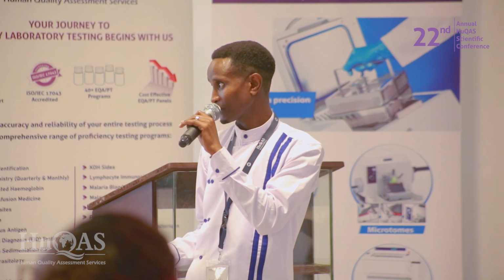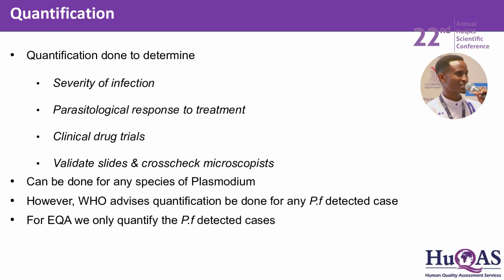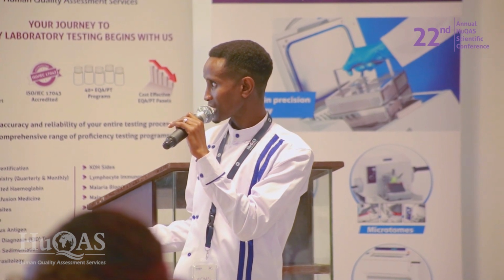But there's an aspect we will also discuss here about EQA, which is advised at this point. According to WHO, you should do species identification, and once you do species identification for PF, you're supposed to do quantification. But depending on your SOP, kindly do what is necessary at your facility. That is what we do in our EQA program. When you do the validation of the slides and cross-check of microscopies, the quantification aspect is very much looked at.